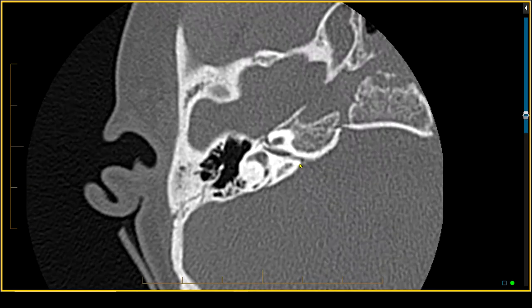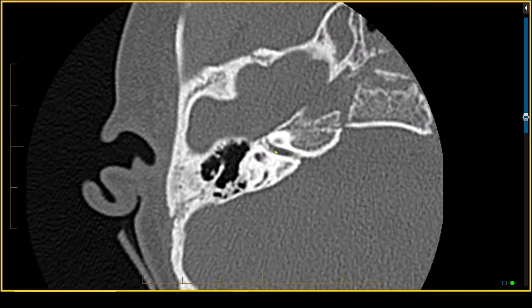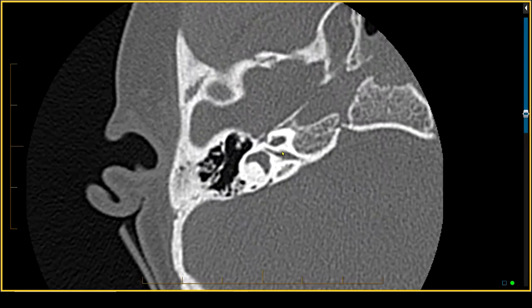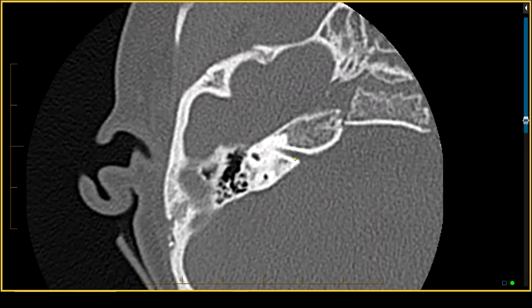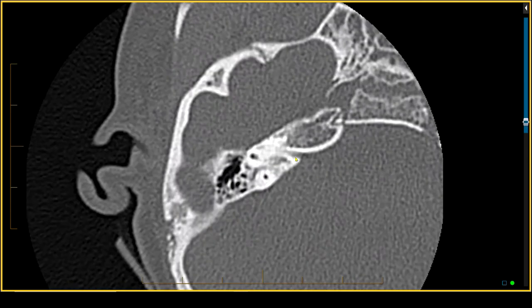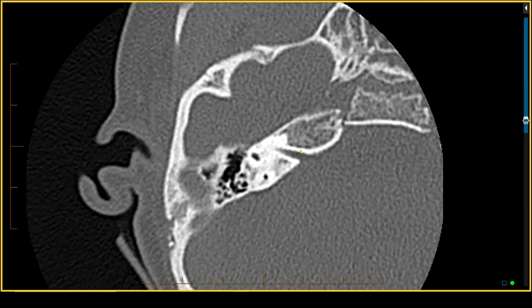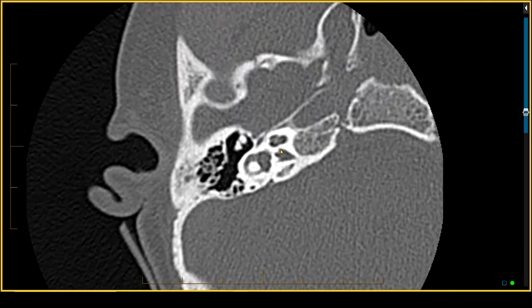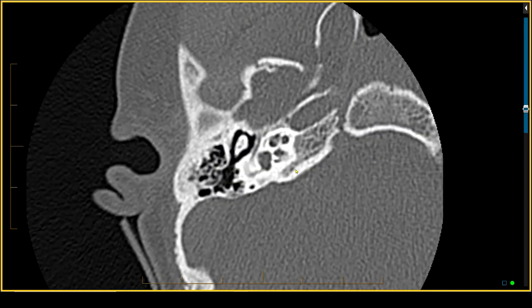Returning to the internal auditory canal — some of you would have noticed this is not a normal width. It is narrowed. When we have narrowing of the internal auditory canal, we are obviously going to be concerned about the potential for cochlear nerve hypoplasia, so we would have to do an MRI scan to evaluate for that. A narrowed internal auditory canal combined with cochlear aperture stenosis puts the patient at high risk of not having a normal cochlear nerve.